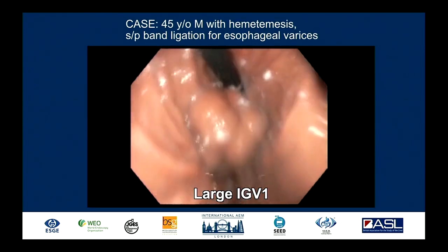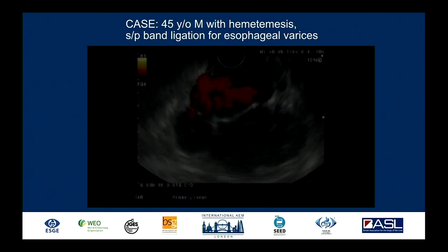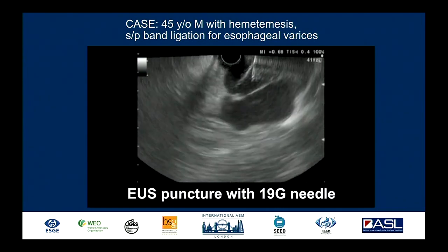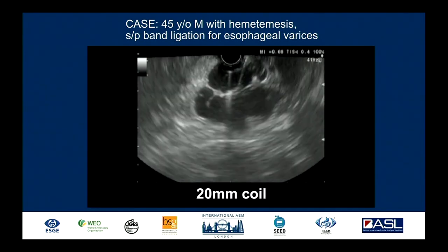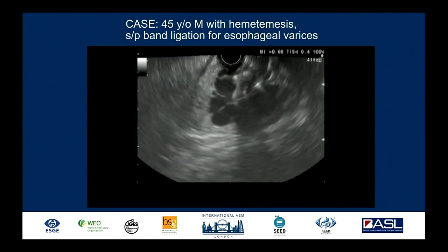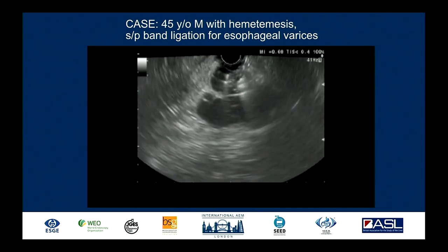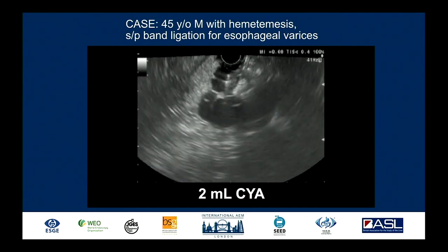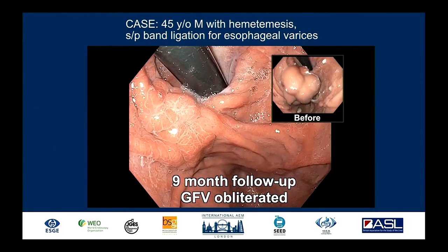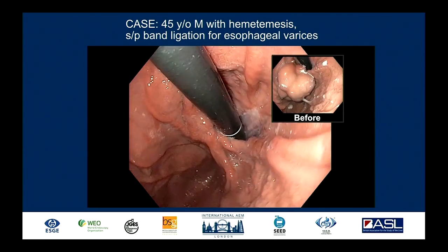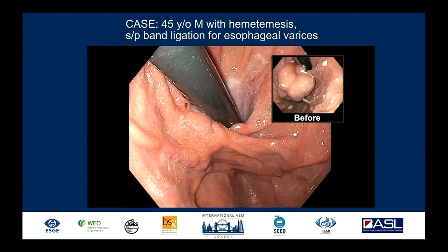This video shows a very impressive case of large IGV-1 gastric varices. With EUS we target the feeder vessel — you can see the coils going in and unraveling. We place one coil not to obliterate with coils alone, but as a scaffold to retain the glue. We follow with injection of glue, which attaches to the woolly fibers. Under ultrasound we can see if glue embolizes or flows away. By targeting the feeder vessel we've reduced, if not eliminated, the risk of glue embolization.